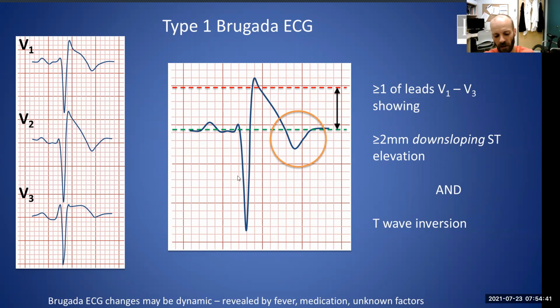If it is moving up and down, then you've got to take your best guess at it. It may be that rather than being a flat line like this, the baseline may be sloped. If you can see that some are at different levels, the conclusion you arrive at may be that you can't say whether or not there is. You can say this is a suspicious ECG, but the ECG needs to be repeated.